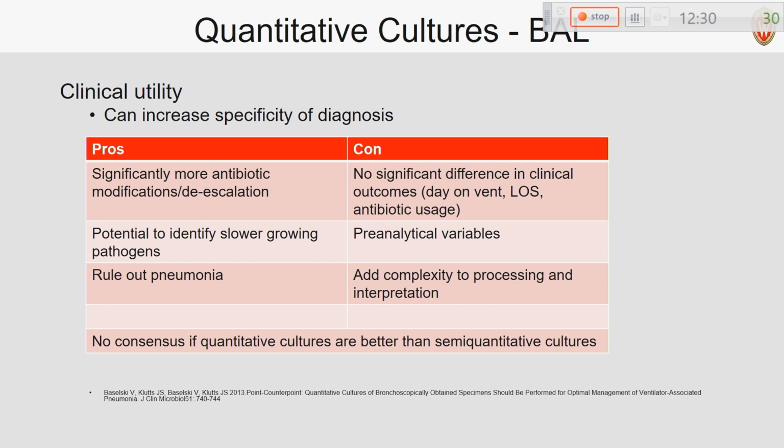So one of my questions on this, again, for audience participation: are there labs out there doing the quantitative cultures? I see Tom shaking his head because we've had some of this discussion before. Do you have any comments on it, how your providers utilize it? Do you think it's useful? How long have you been doing them?